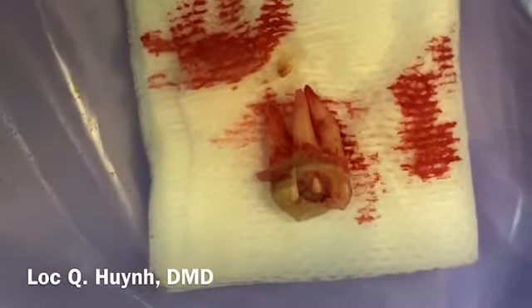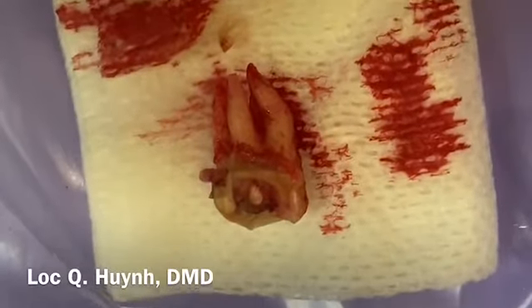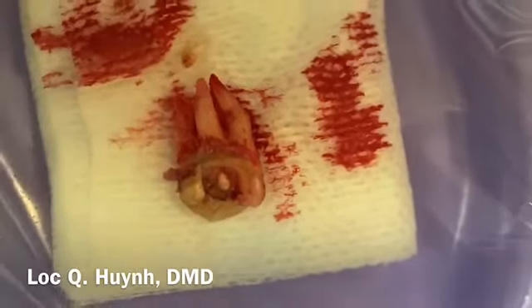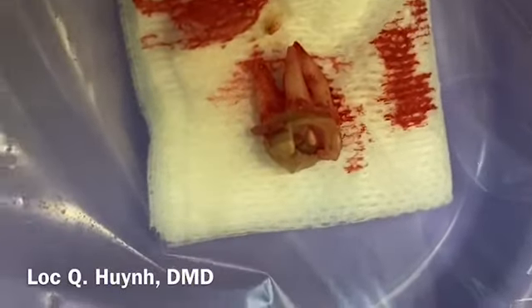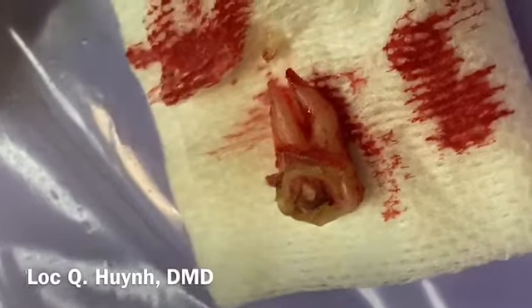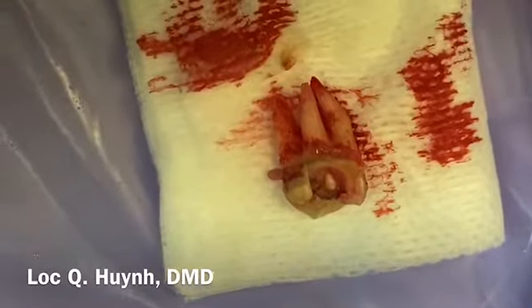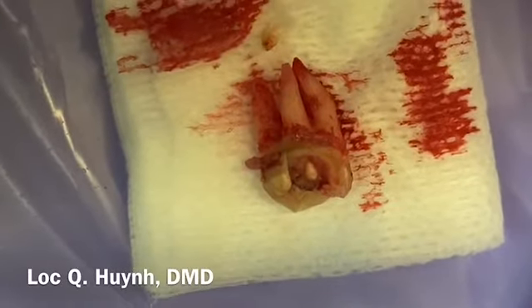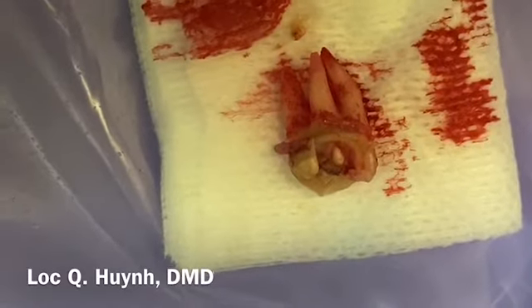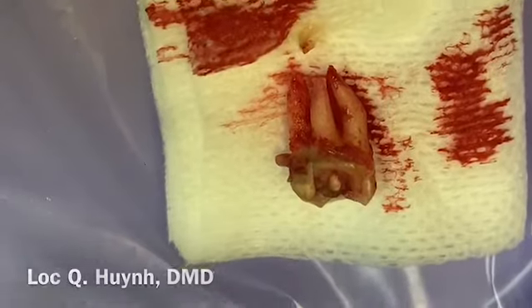And if you're not careful, like I said, some people use so much force they might break the distal tuberosity part of the tooth, which gives the patient more trouble post-op. You don't want that to happen, so you have to be able to luxate and also use the 150 forceps and take it out as nicely as possible. So as you can see, there's no break in the tuberosity. The tooth came out very nicely.